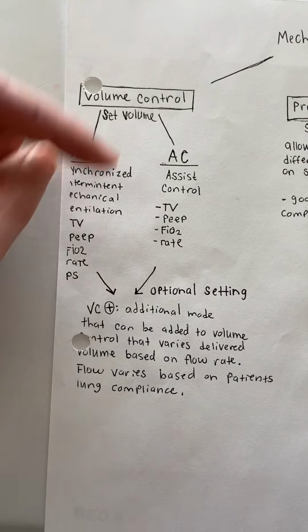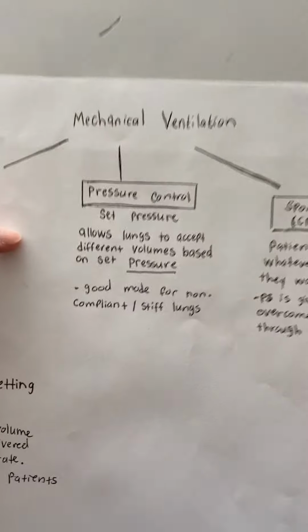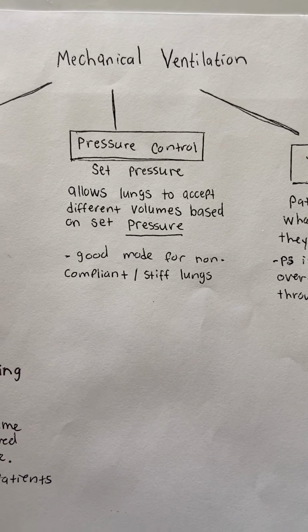I'll come back to this. Moving over to pressure control, it is very similar. The difference with pressure control is that instead of setting a tidal volume, you set a pressure. So this is a good mode of ventilation.